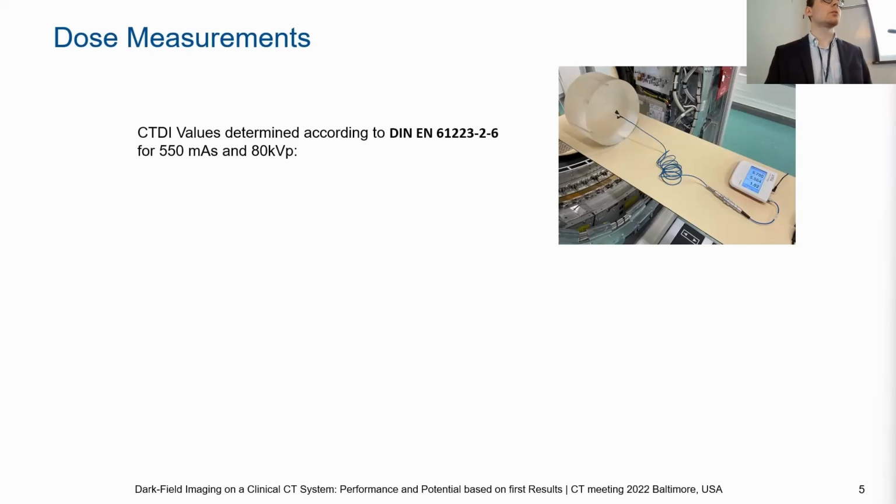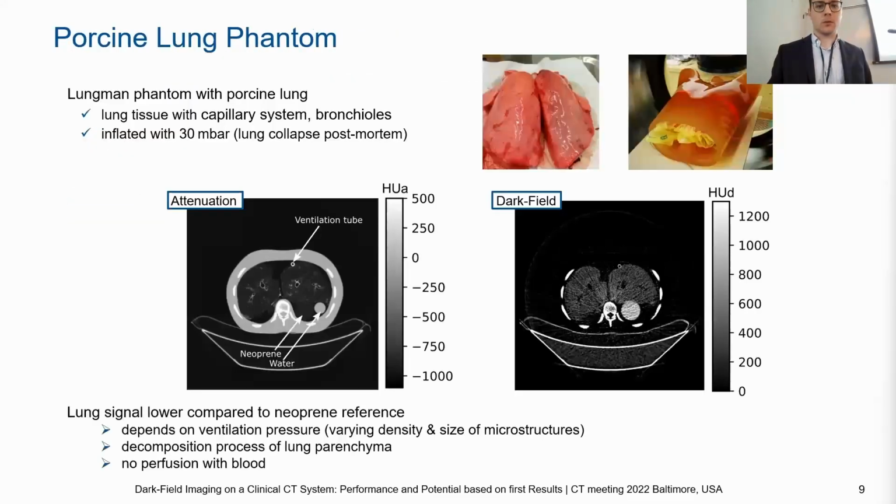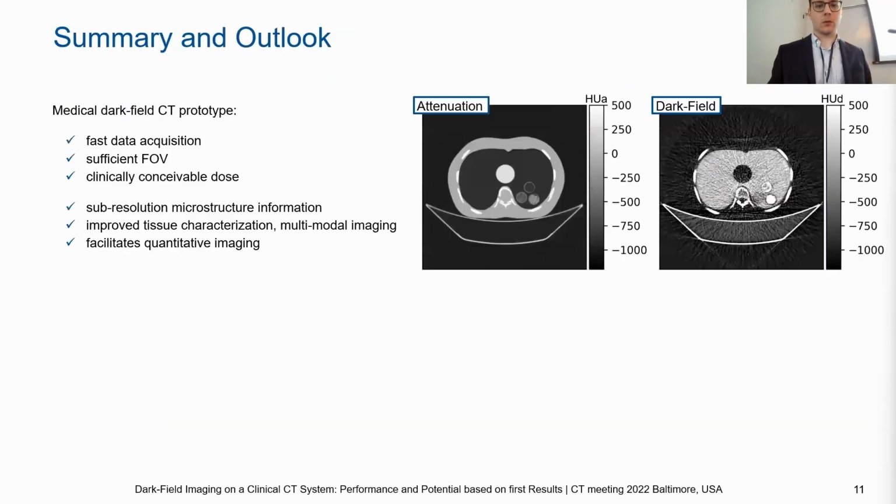The images look very impressive, but the artifacts that are remaining, do you think those are primarily noise? It seems like I also see a little bit of aliasing artifacts potentially. What we can see here is definitely noise. For example, here you can see a remaining artifact from the edge, and again, here at the table, you can see these slight streaks.